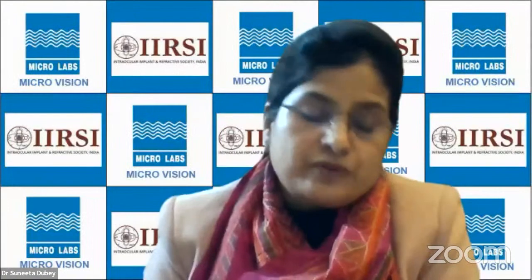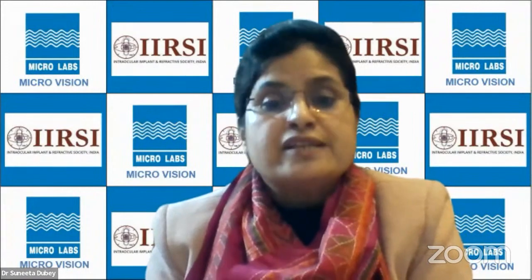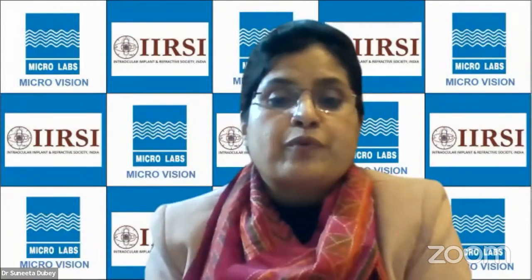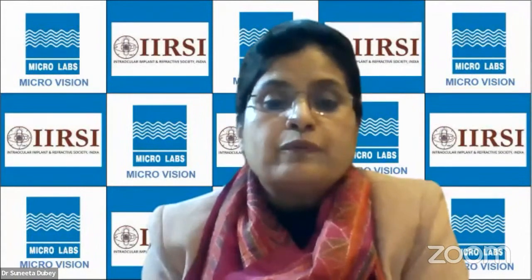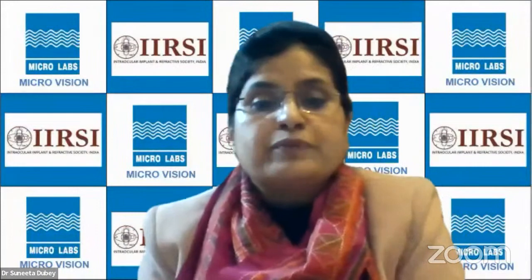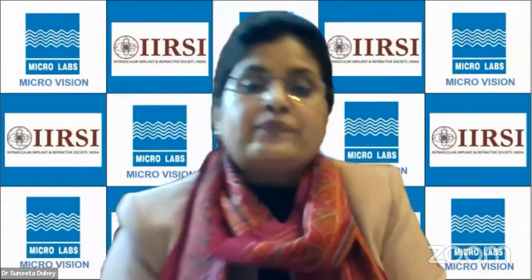So what precautions? Because generally we have seen peribulbar being given inferotemporally as well as supranasally. So would you give at both the places or just inferotemporally? Because when you give supranasally, there is a lot of chemosis and it is closer to the optic nerve also. So what will you suggest?